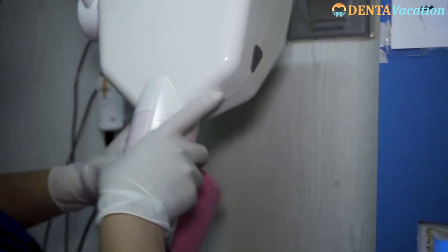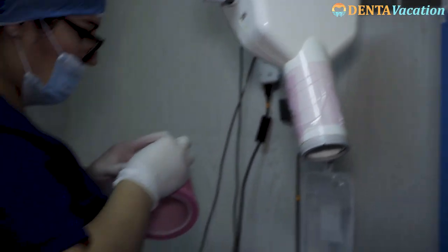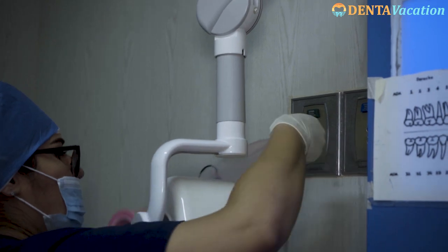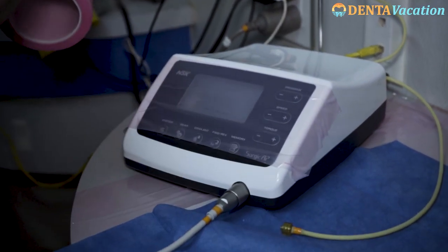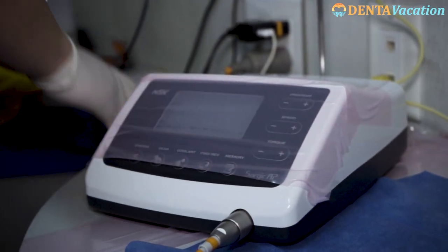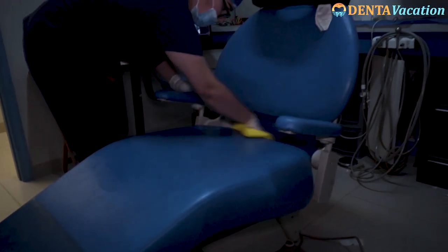Attendants then paste sterile tape on devices which the dentist touches during the procedure but cannot be sterilized because of electric components. These include implant machines, light controls, and the dental chair. The dental chair is also wiped with disinfectant.